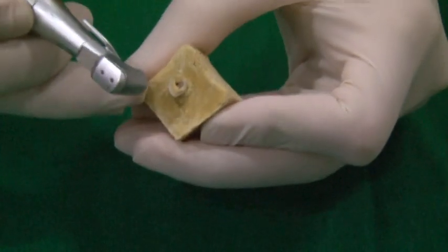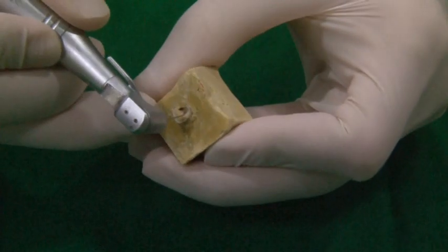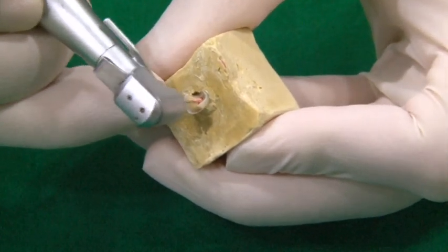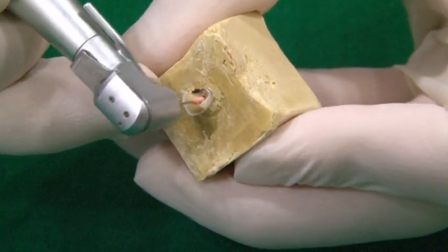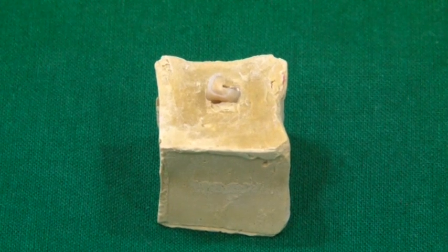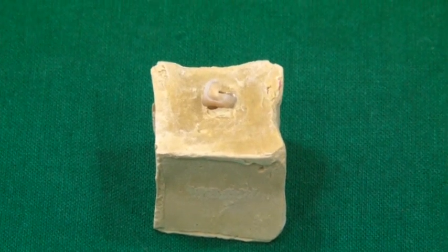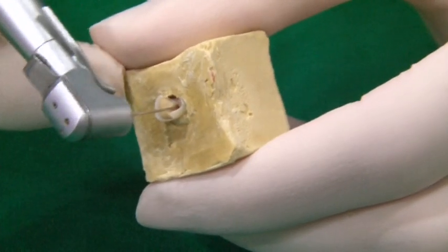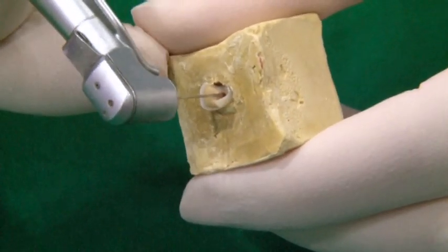The post space preparation is done using successive sizes of pisoremas or Gates Glidden drills on a low-speed drill. The smallest piso is used first till the required length. The size of this piso should be narrower than the canal, so it follows the path of the GP and does not engage dentin.